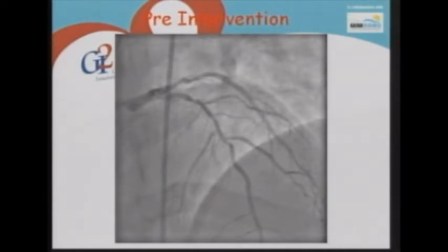Yes, Roberto? In this case, Alex, I think there are two key points. One is side branches and the other is the tapering LAD. And again, the sizing of this scaffold device is completely different from our current practice for metallic stents. And then you have here a very teaching case so that you can share with us what is your approach for these topics, mostly sizing of the device and the tapering of the LAD. How do you approach this with the scaffold device?